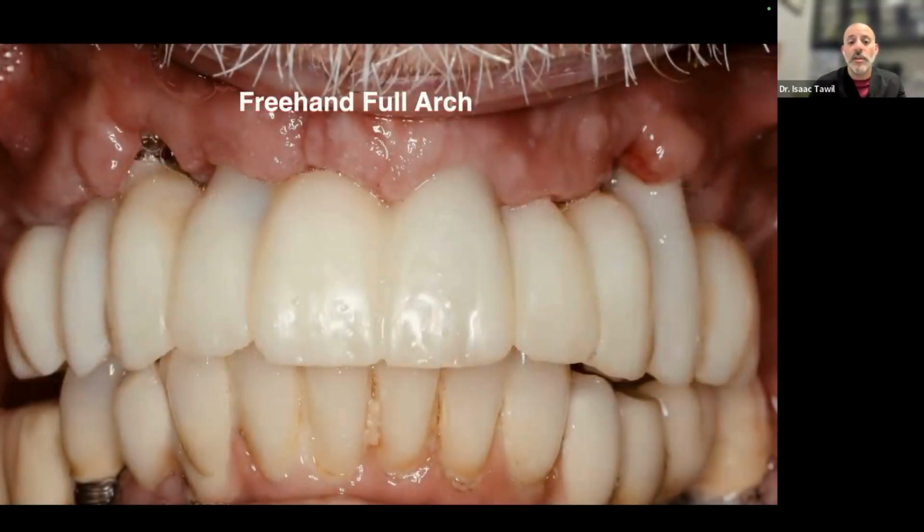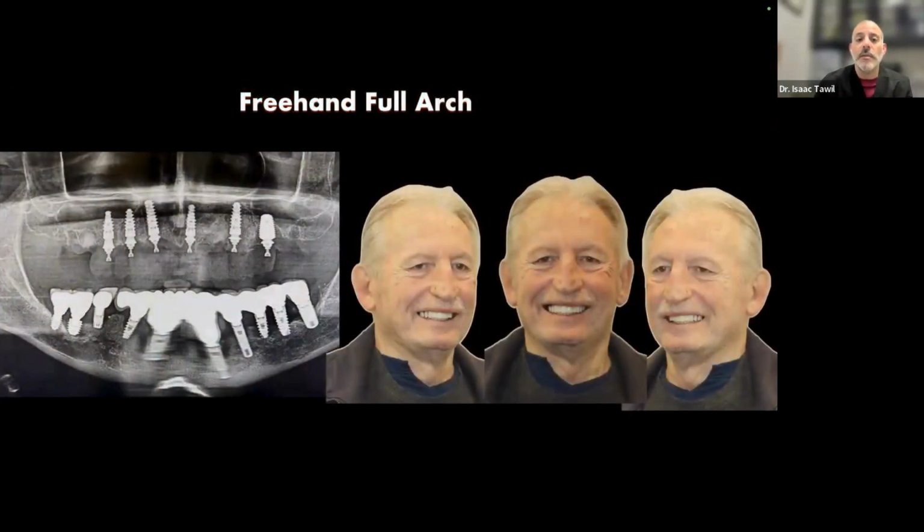And this is the cancer patient survivor who was getting some teeth. So he's ready for teeth, but this is the surgery, and we were just talking about surgery. So you can see how he left very happy, not missing teeth. And I didn't have to use a guide for this. I was able to do this free-handed. I would have had to do an intraoral pickup, but I just made a printed provisional.